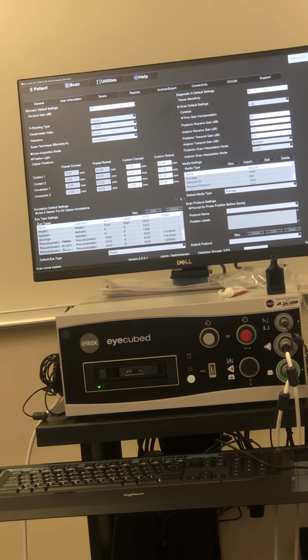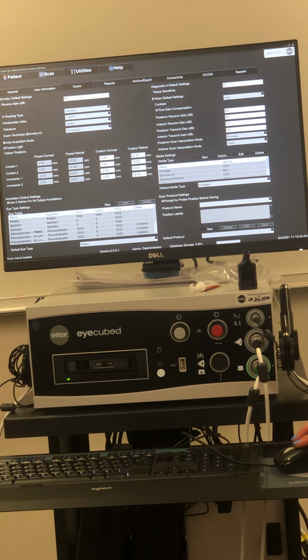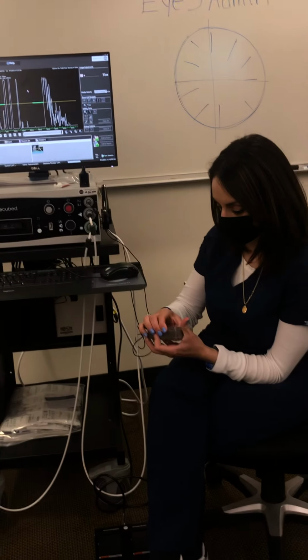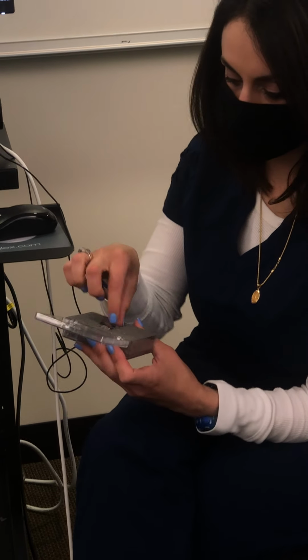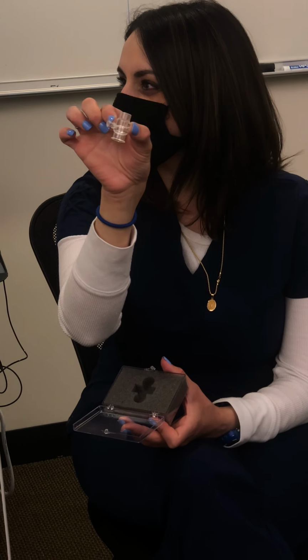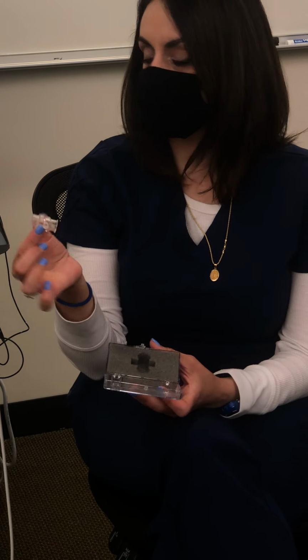So where's my A scan? It should have been 68. I think on this particular scan it was 73. So this is going to be your shell. Oh, that's the one I did. This is your cone shell, and my colleague is Gus Cone. He's the one that developed this. Do you know Gus? No. Gus has worked for all the ultrasound companies over the years, and he's with us now.